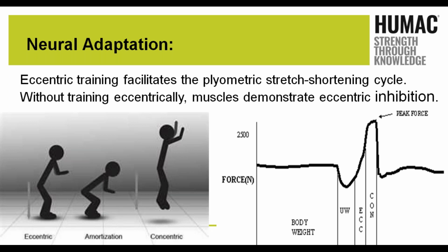If we use this correctly, we're able to actually generate more force concentrically, or in our acceleration phase. And those become important to us across the board. So all of those concepts are important. But tonight, it's really about the speed, because I think if there's one area in isokinetics that has probably been miscued for a long period of time, it's really understanding velocity of movement and speed of contraction, and that's part of what we're going to be looking at.